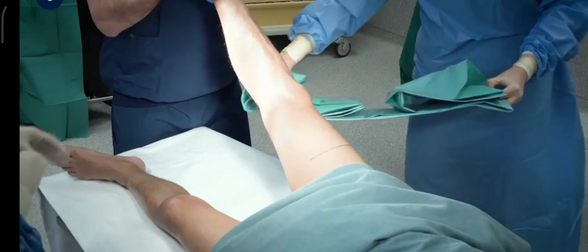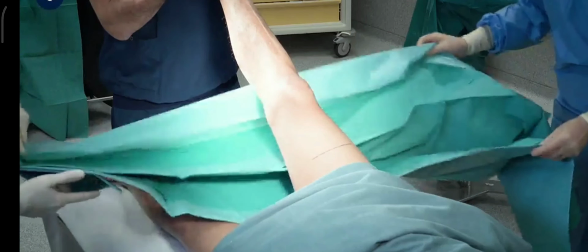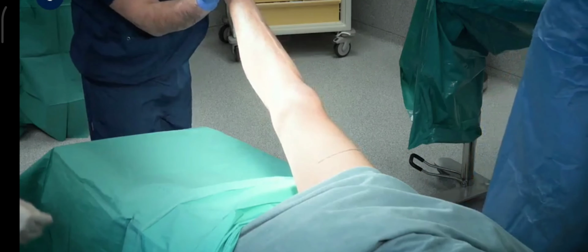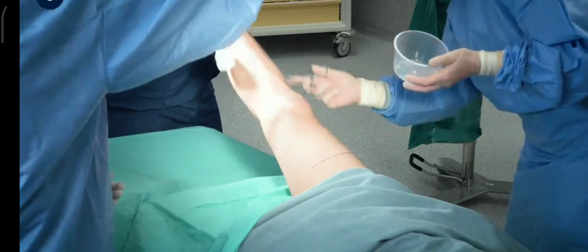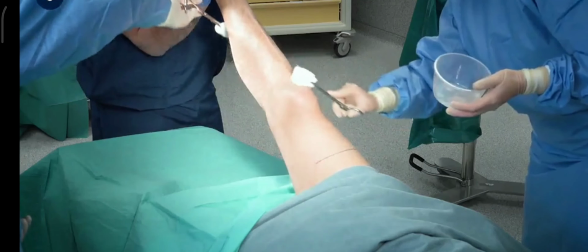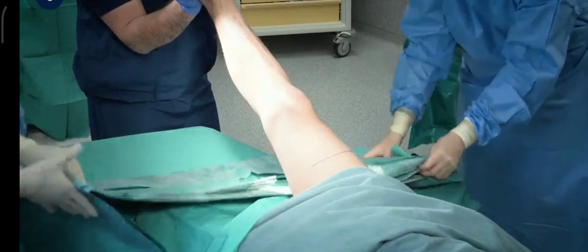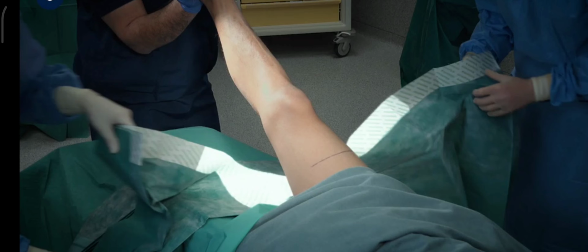A large, non-adhesive sheet is placed beneath the leg and is unfolded by both the scrub nurse and the surgeon as shown. In some centres, the preference is to place the ground sheet after cleaning the limb. Once this ground sheet is in place, the scrub nurse and surgeon clean the surgical site, circumferentially and in a systematic manner. The U-sheet is manoeuvred into position by the scrub nurse and the surgeon as shown. Take note of the U-shape for which the sheet is named.